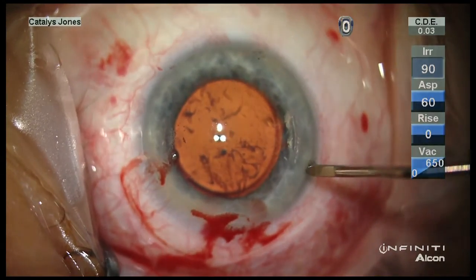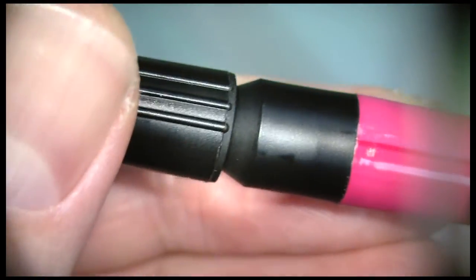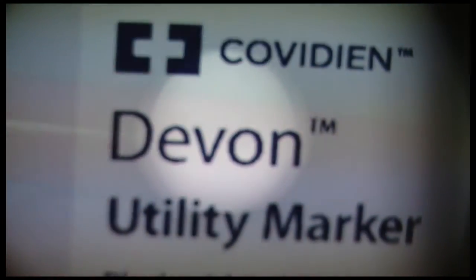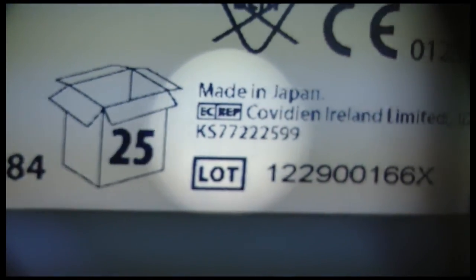The marker itself is supplied as a fairly normal looking felt tip marker with black ink. This marker comes in a sealed sterile pouch, which can be opened on a back table, and it's been very easy to apply, as you can see from this video. Thank you.